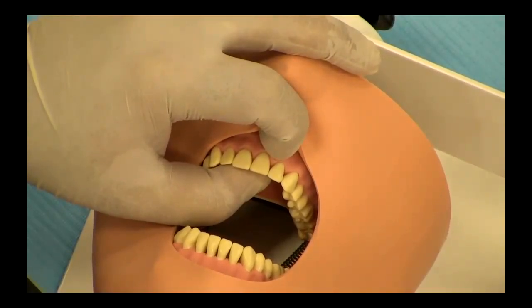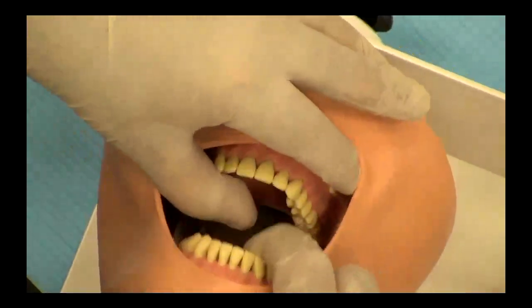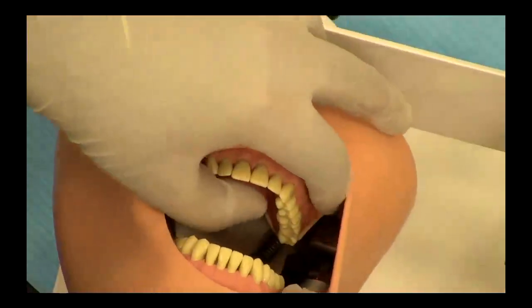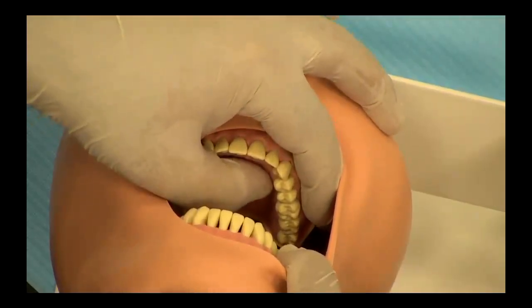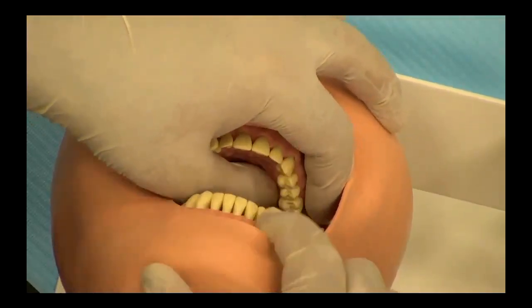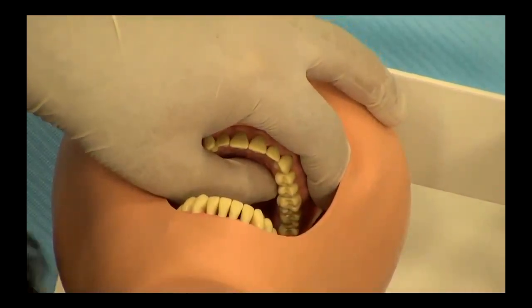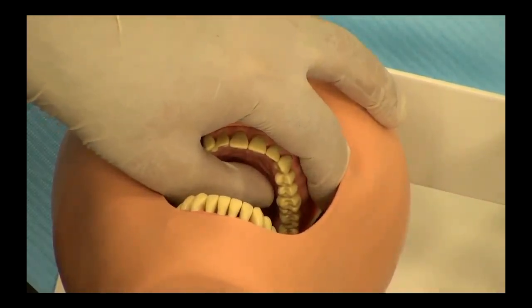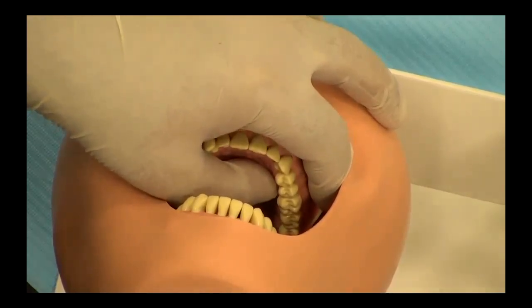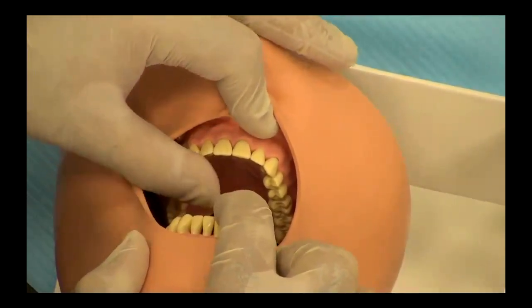And for the maxillary left posterior area, you can simply slide across, keeping your forefinger on the buccal side and the thumb on the palate, and then you can apply your forceps as you need to carry out the tooth extraction. So forefinger on the buccal side, thumb on the palate, just like the maxillary anterior region.